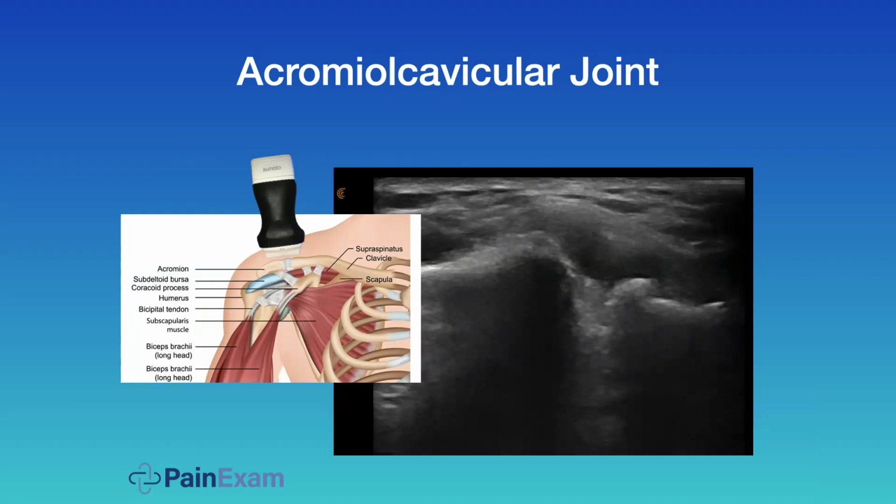Okay, here we have the ultrasound visualizing the joint. It's a very small joint, and you can imagine it's going to be very difficult to do a joint injection coming in plane with this approach. So you may need to come out of plane, which is fairly doable. It's a small joint, maybe half a milliliter at most, maybe a milliliter it could hold.